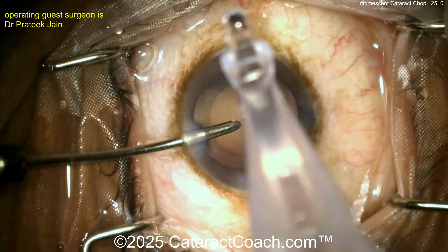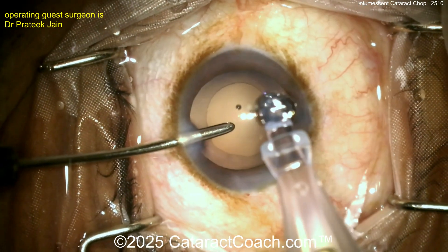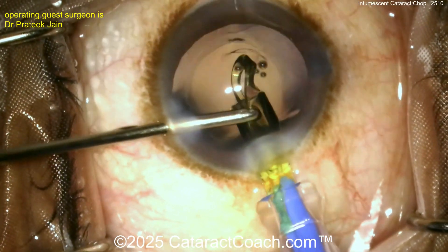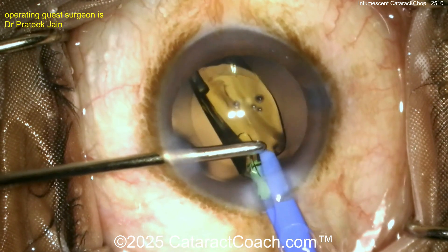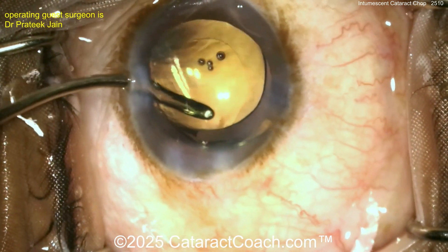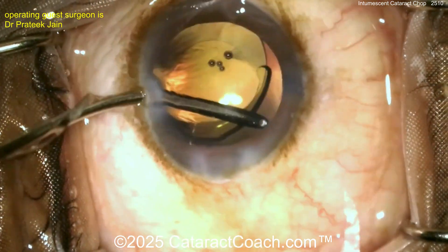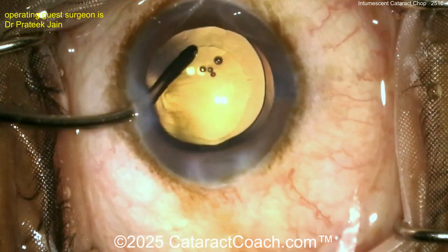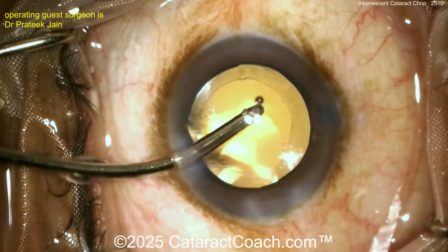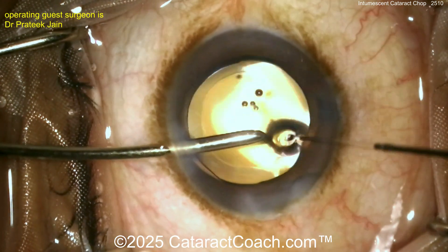Here's an advantage of bimanual IA — look, the left hand is just the infusion. This is hydro-implantation: the left hand infusion is filling the bag with BSS, and then the right hand is injecting the IOL — it goes right into the capsular bag. So you don't need an extra viscoelastic here to inflate the bag. That works great. Get that lens dialed in — fantastic.